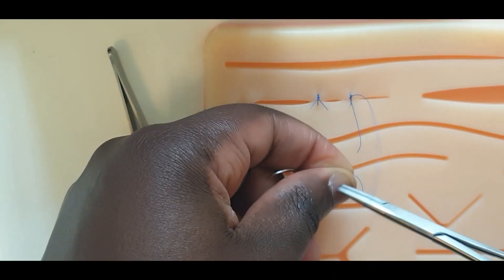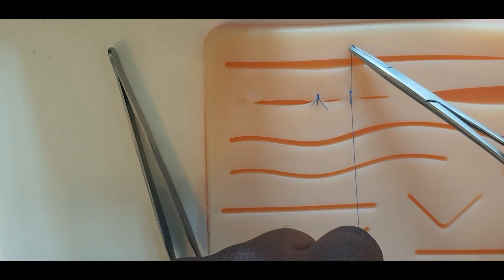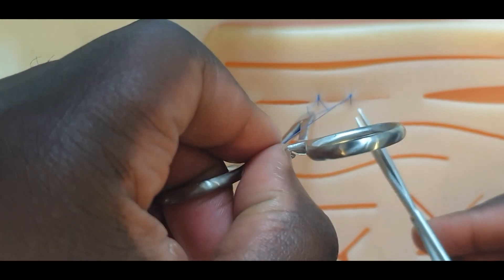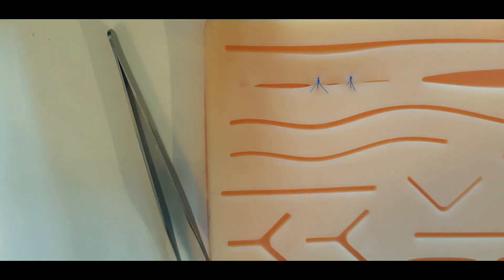This allows the wound to be further tensioned and the wound edges further approximated. The position of the threads of the reef knot that follows this are alternated to secure the knot.